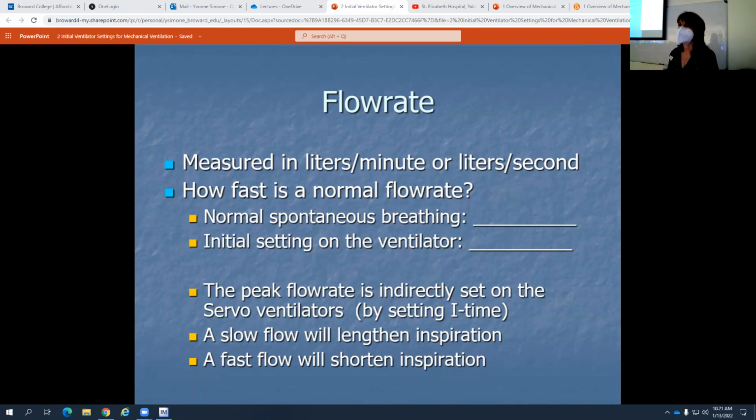This may be a really stupid question, but I don't understand what you mean when you say that if they're breathing fast, then you would increase the flow rate, because aren't they not breathing? That's why we have them on the ventilator. Aren't we deciding on the breathing? So we're assisting the breathing. So not always is somebody completely not breathing. Maybe if they're heavily sedated, maybe if they fractured C3, C4, and C5 and they can't breathe on their own, then we would do all the breathing for them. Everybody else falls into the category of they're breathing but not good enough, and we have to help them.